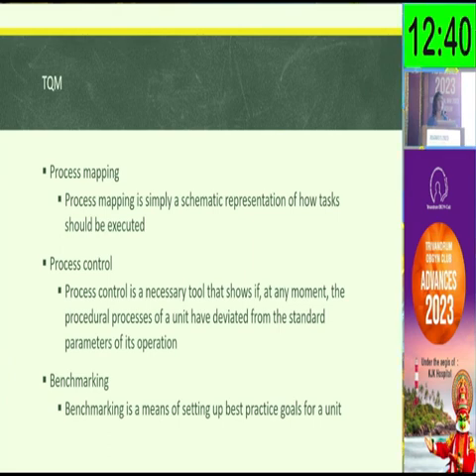And then, of course, the benchmarking. Every lab has a benchmarking. There are KPIs that have been determined by the experts. Of course, there is very little evidence based on which those KPIs have arrived. But yes, we do have KPIs set by the experts, but we also have individual KPIs based on the set of patients that we cater to. We cannot, for example, expect a 60 to 70% blast formation rate when a lab is catering probably to the age of 39 and 42 maximum.